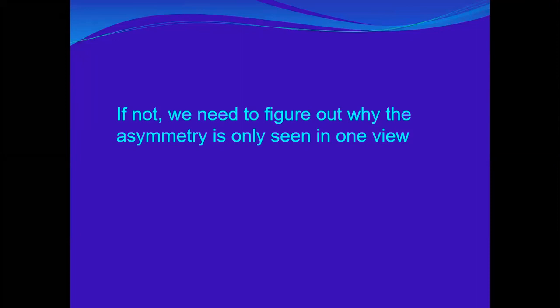I will do spot compression first. Before doing the spot compression, I will do a true lateral.